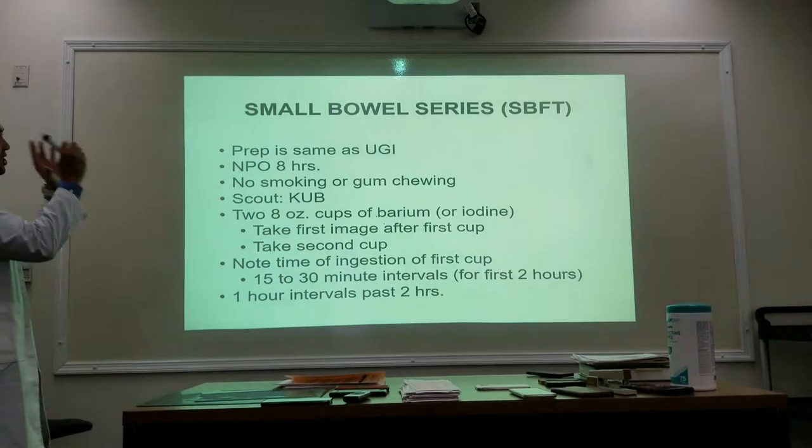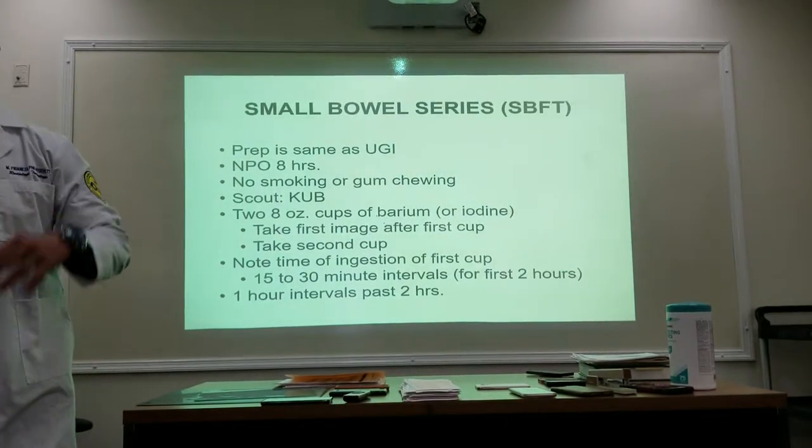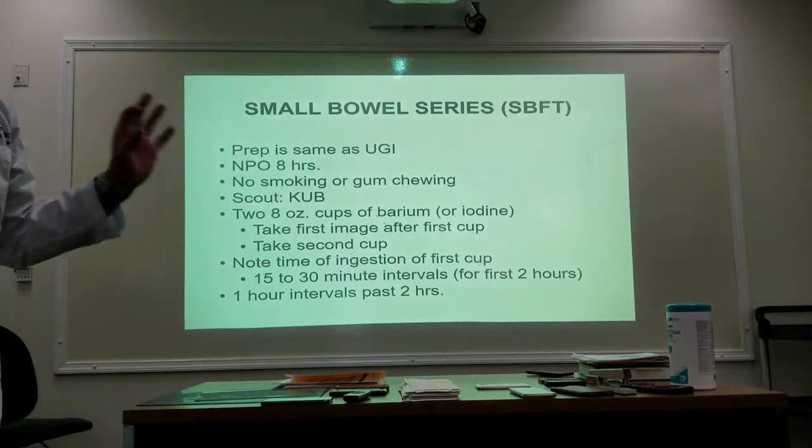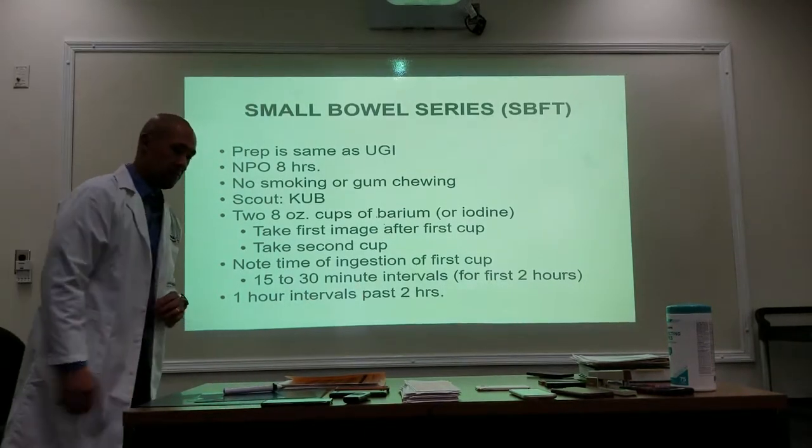Okay. So again, this is just a standalone small bowel series. We're not doing it with an upper GI. We're not doing it with an esophagram. Patient just shows up for a small bowel series. That's it. Okay.